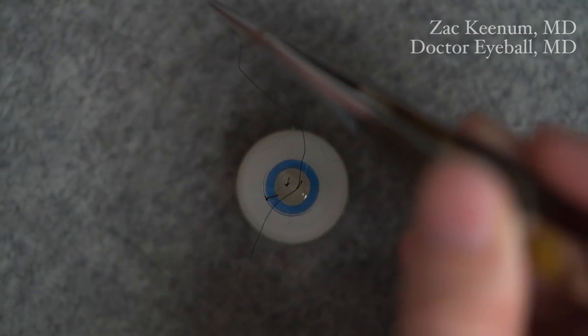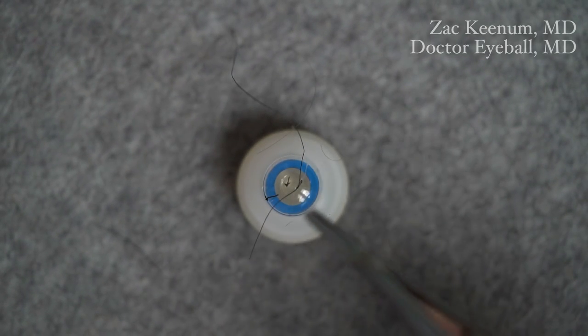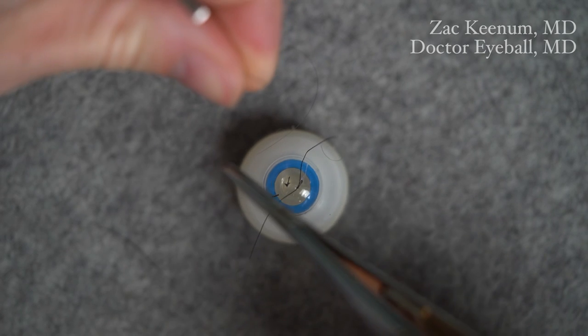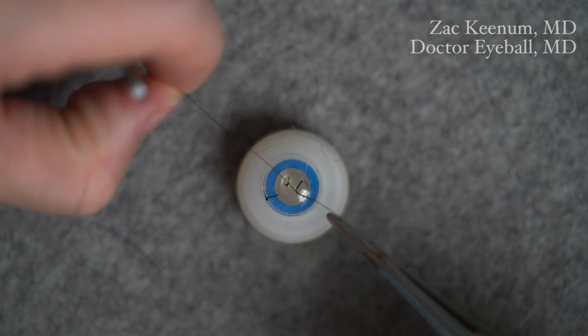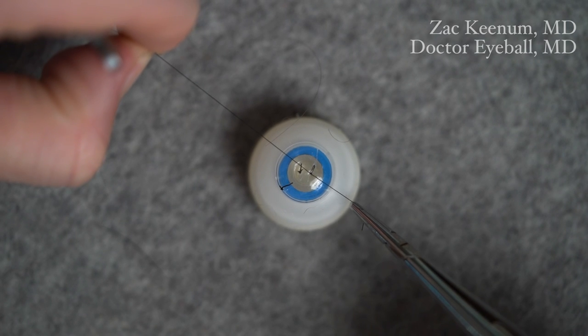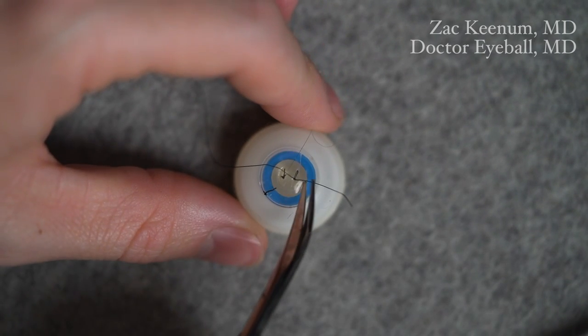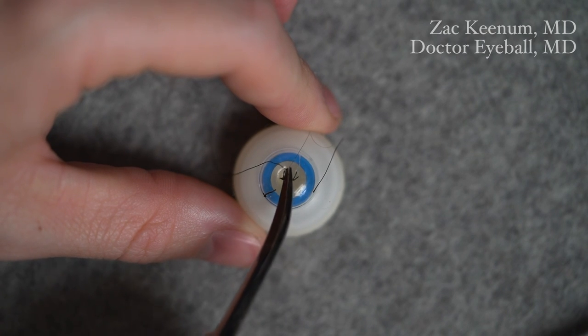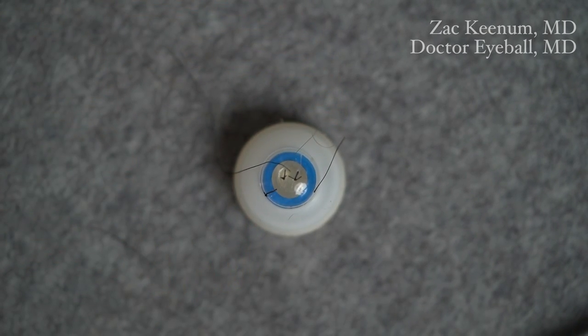I'll grab the long end — you would be using an instrument here, but since I'm demonstrating with a larger suture, I'm using my fingers. I come from within the loop, grab the short tail in the normal way, and pull 90 degrees. That locks the stitch. Now the suture is locked and keeps the tension we had decided after the second throw. We can trim the tails and do that to all the sutures — that's the benefit here.